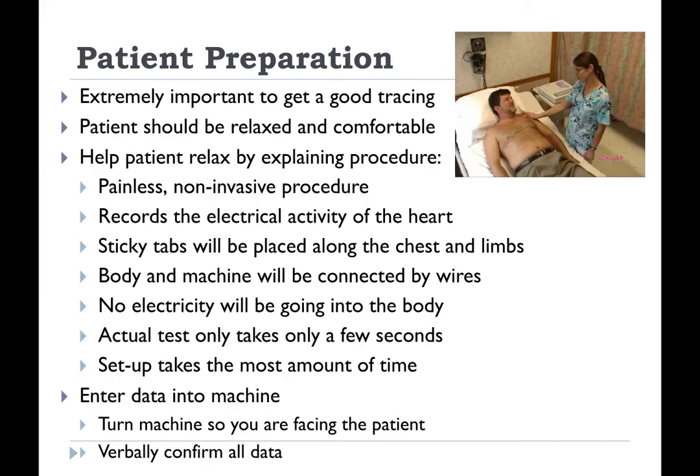The patient should be relaxed and comfortable. You can help them relax by explaining the procedure. It always helps if you ask them if they've had it done before. If they have, then you can just remind them of these points, but if not, they may be very nervous or scared. So you're going to let them know that it's a painless, non-invasive procedure that records the electrical activity of their heart. You're going to place sticky tabs along their chest and limbs, or arms and legs, and their body and the machine will be connected by wires, but absolutely no electricity will be going into their body. And the actual test itself only takes a few seconds, and it's the setup that takes the most amount of time.